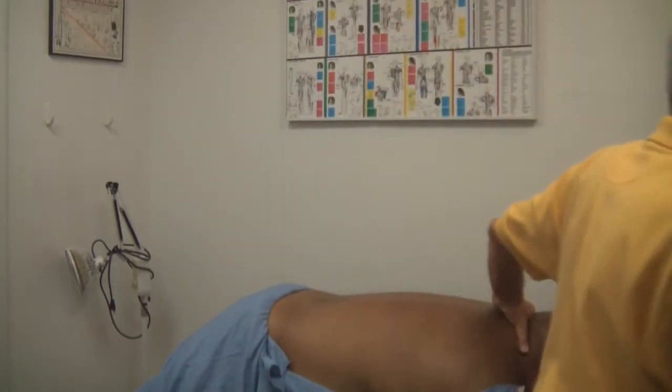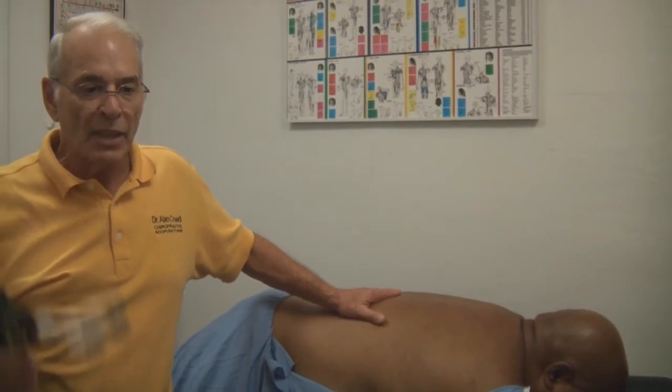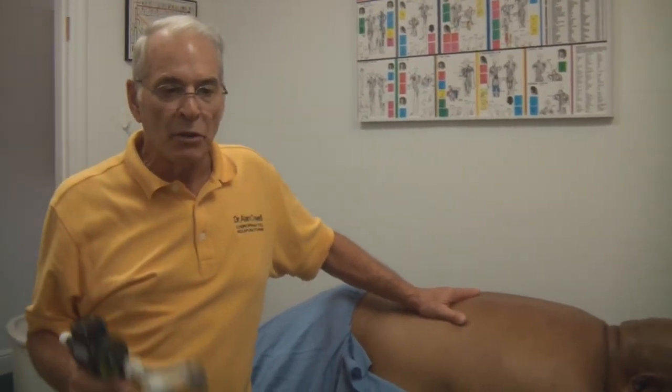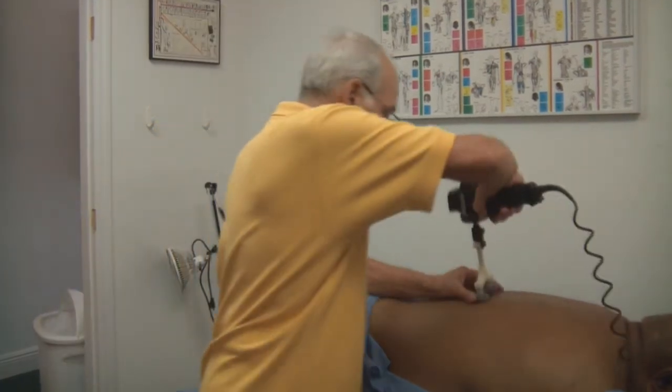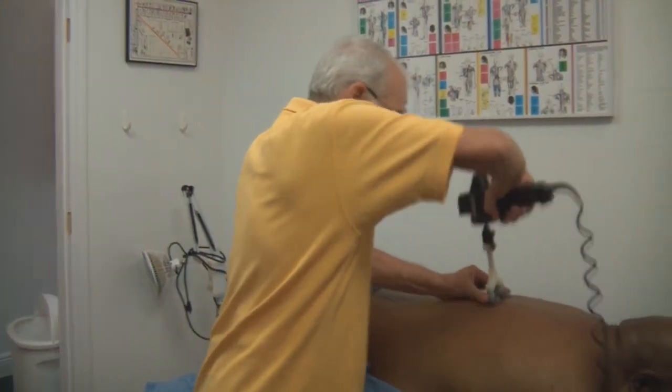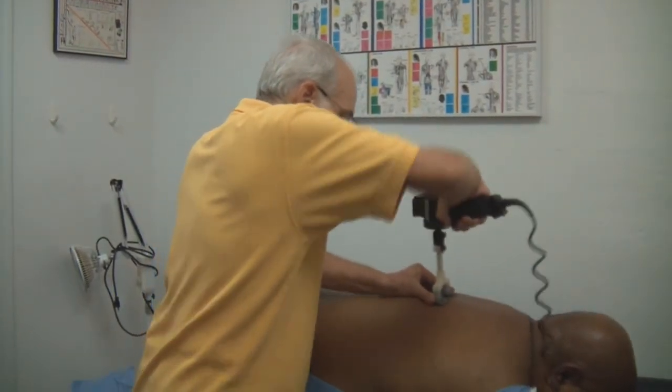So what we're dealing with in our world, which we're going to show you with this gentleman, is we have to think about the gravitational factors that are applied to the individual as they go through life in general. If you can reduce those pulls, the person will feel a lot better.